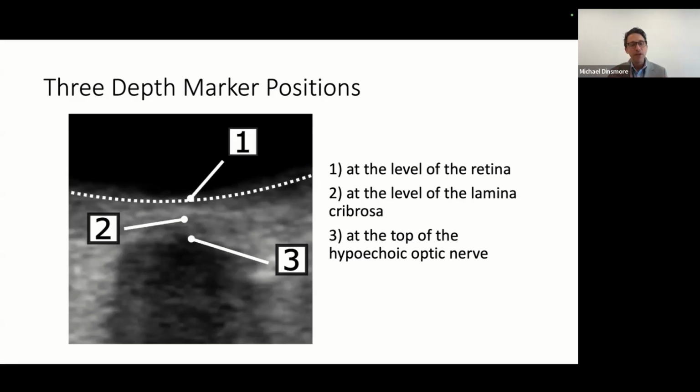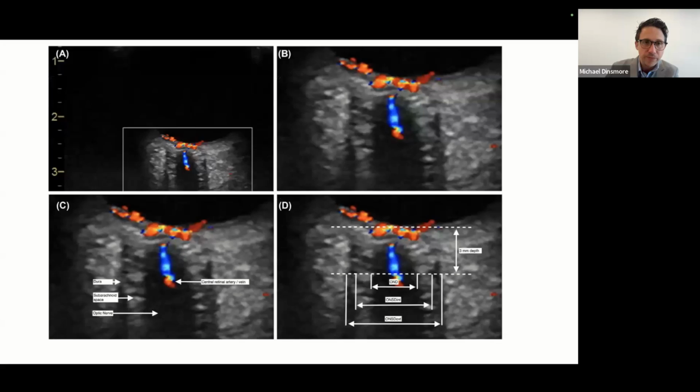But the reason we do 3 millimeters is because that's the greatest bang for your buck at that distance. So 20 years ago, they injected gelatin in cadaver studies. And even though you got direct proportional expansion with ICP at all the distances behind the nerve at 1, 3, 5, and 9, 3 was the most at 3. So if you can optimize this for a protocol, it's probably the best going forward.